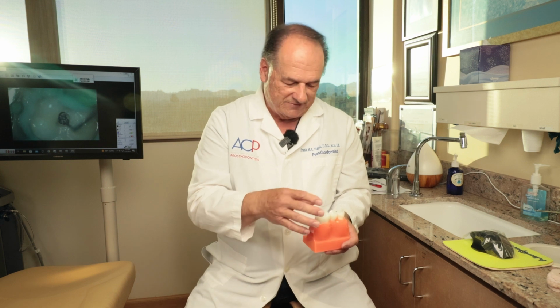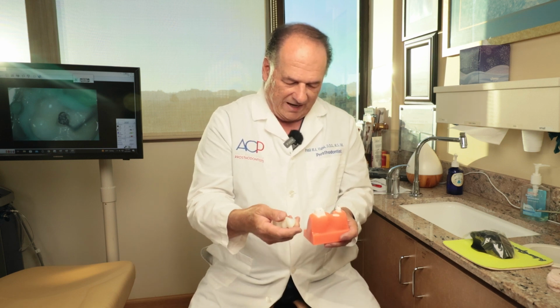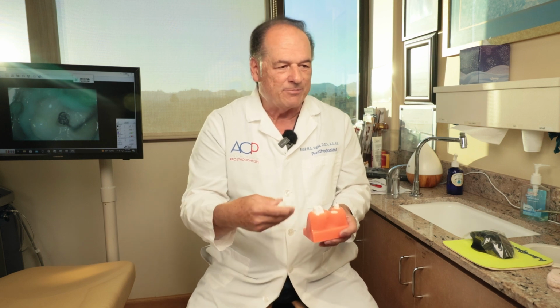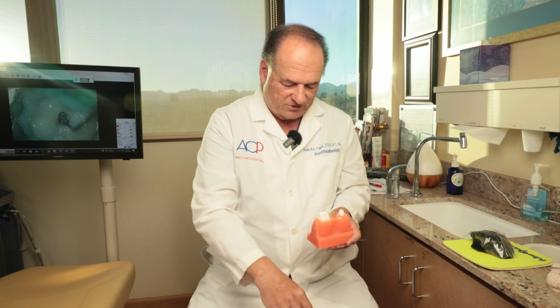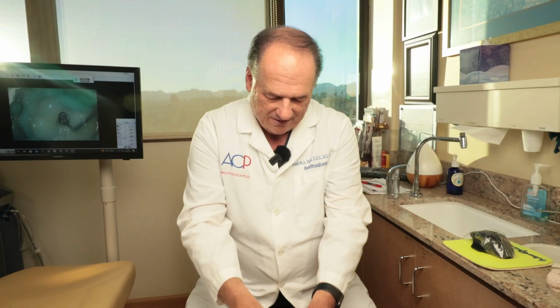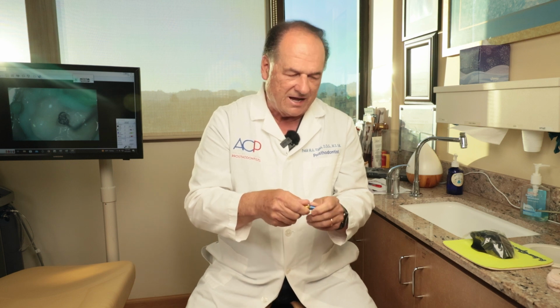So as I mentioned, this is not a new concept. What became a new concept, and an option for treatment not that long ago, was to be able to place a prosthetic tooth, an artificial tooth, meaning an artificial root. So we're not dealing with a tooth. An implant is not a tooth.